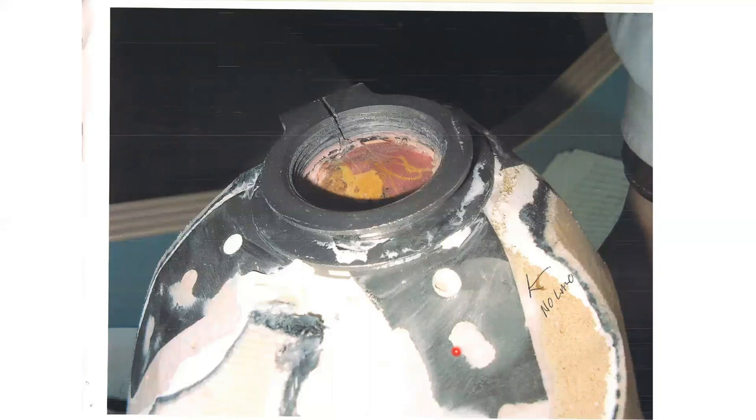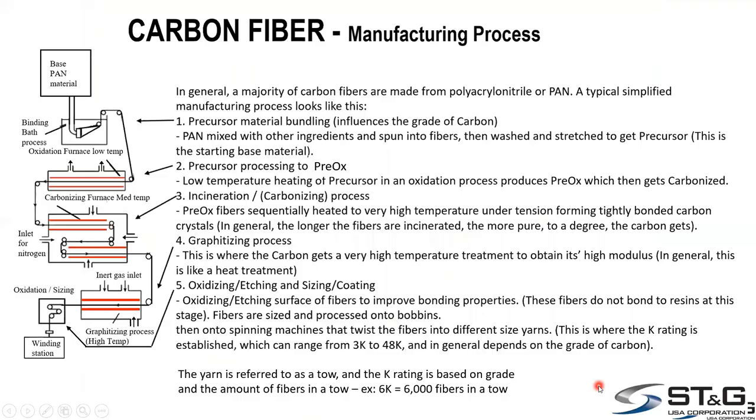So you can see here, we can see the foam. We can see the component that was bonded directly on it, probably with light putty. There wasn't even a layer of sealing resin on it. But either way, it should have been a socket. It should have had a lamination layer, and then you bond this socket adapter on and then tie up the layers.